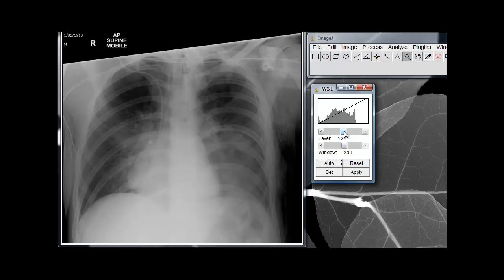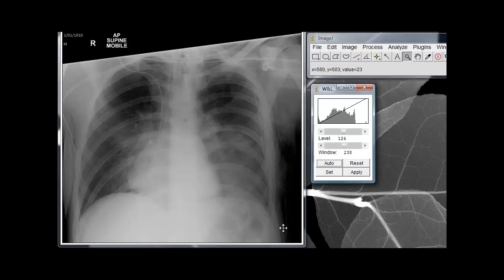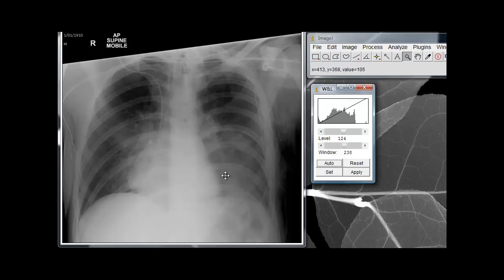Traditionally we do a five-step critique. Step 1 is anatomy and positioning. For this particular one, the anatomy required is both lungs — both apices need to be displayed as well as the bases of the lungs, including the costophrenic angles on either side. We want to see a little bit of spine shadow through the mediastinum and the heart shadow as well. Normally the heart shadow is more off to the patient's left, our right as we're viewing, but it's shifted the opposite way, which indicates some rotation.